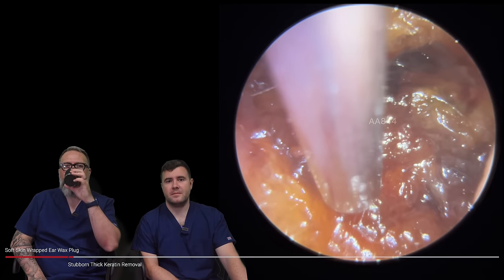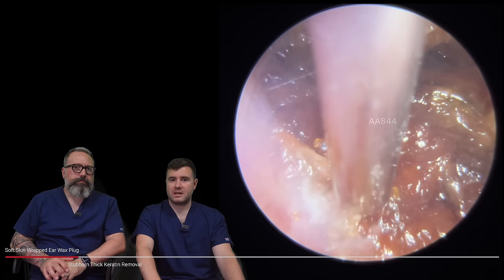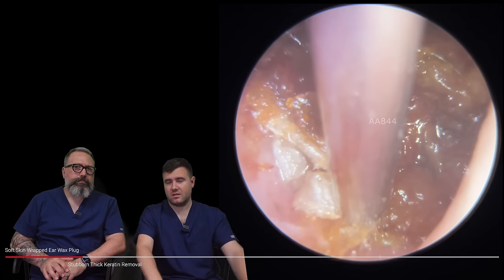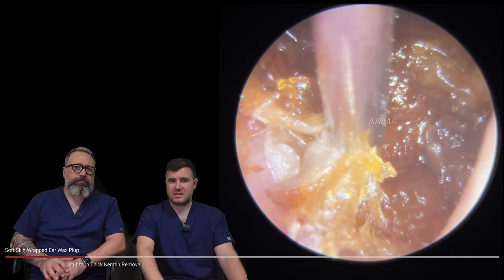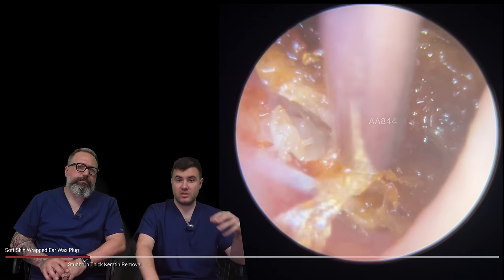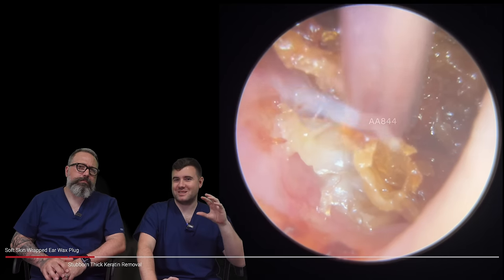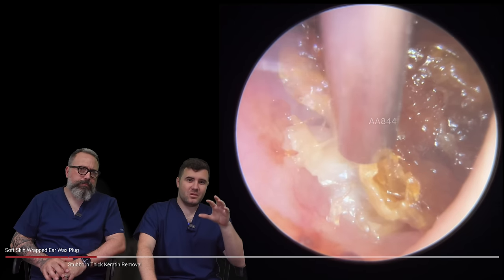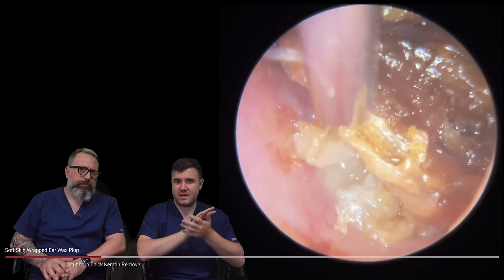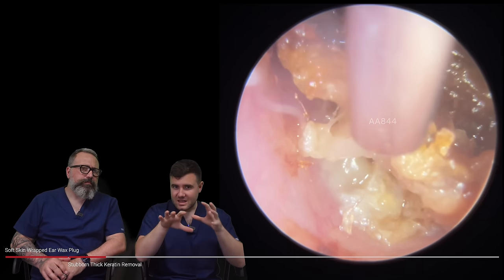This is a really interesting one. A lady came in to see me — this particular patient has had some bad experiences in the past with wax removal. Found it really painful, had quite severe dizziness after it, and just really had some bad experiences with wax. So the patient was really really nervous coming in. I thought at first this just looks like a really soft wax plug, but what we've actually got here is a lot of keratin — really dry hard skin which is very very stuck, and this is right up against the eardrum.